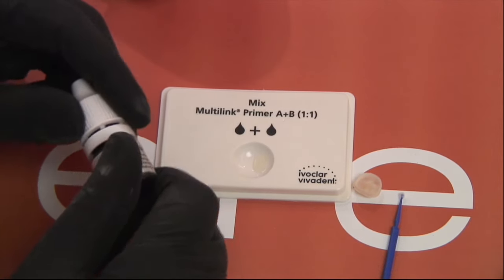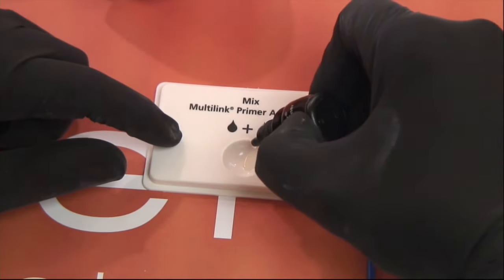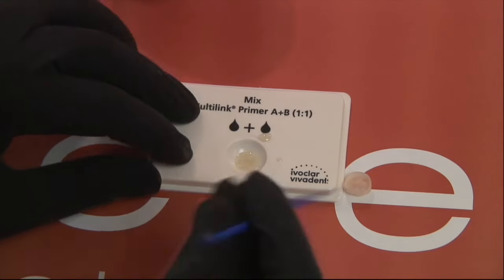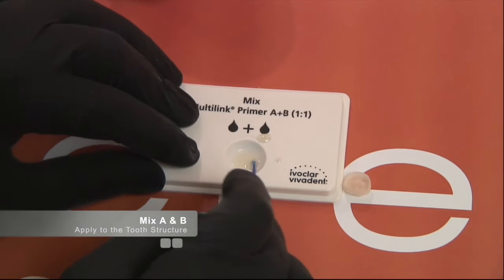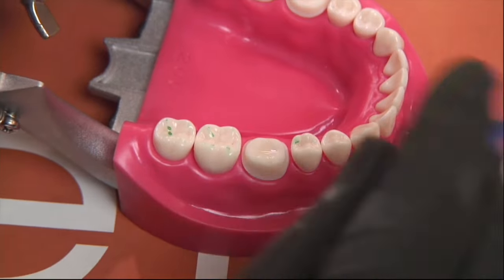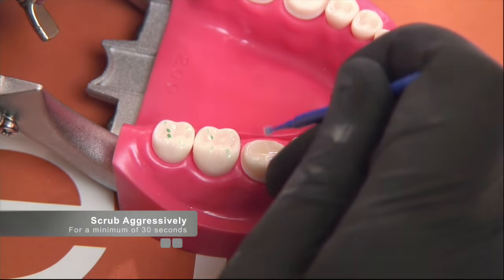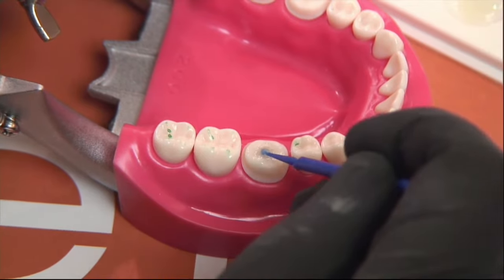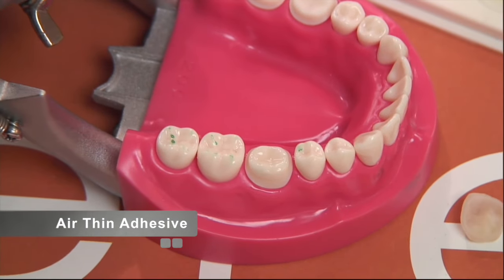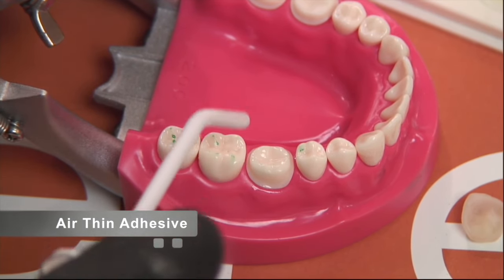Now to prepare the tooth structure, we're going to use multi-link, which is a self-etching bonding agent and resin cement. Take one drop of component A and one drop of component B, mix them together. Nothing else needs to be done to the tooth other than clean the surface. Mix the A and B together and apply it to the tooth structure. With multi-link and any bonding agent, it's critical that you don't just apply it and let it sit — you want to aggressively scrub this in for at least 30 seconds.